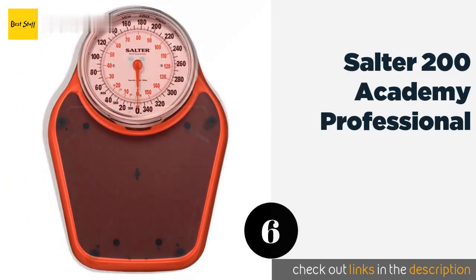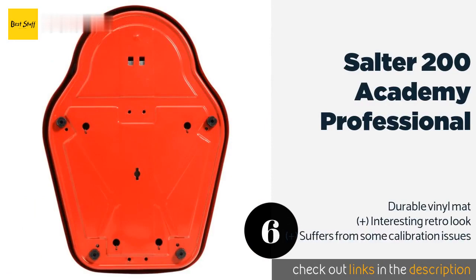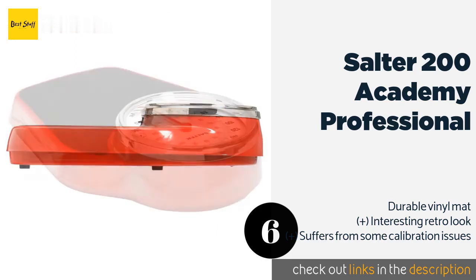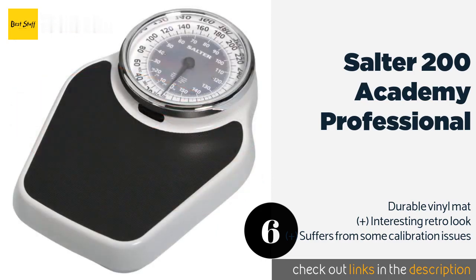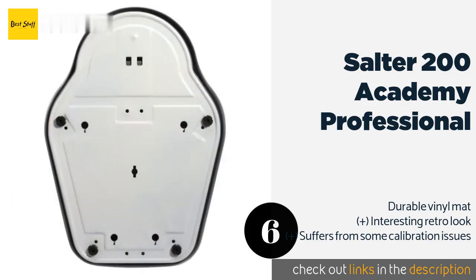Number six is the Salter 200 Academy Professional. With a dial that's just over seven inches wide, the Salter 200 Academy Professional is a substantial, no-nonsense choice. You can choose between red and black, but whichever you select, you can expect it to last for a while, thanks to a powder-coated steel base. This product is available on Amazon for $62 — check out the link in the YouTube description.